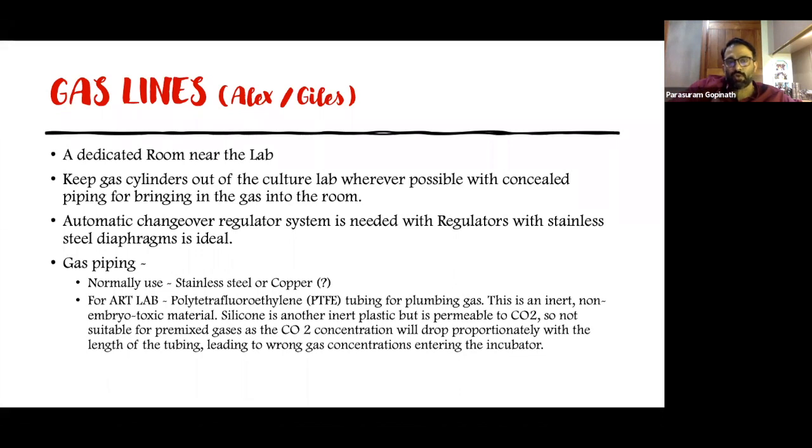Because obviously, with copper, again, there's a big debate. So whether you pass a tube inside the copper tube and then bring it into our main lab, or how do you do it?